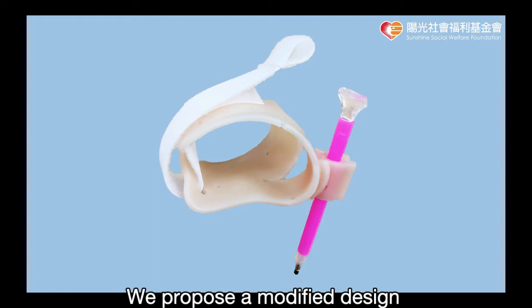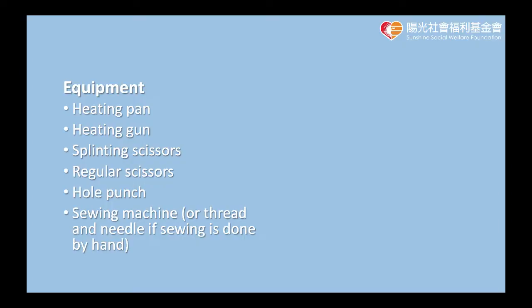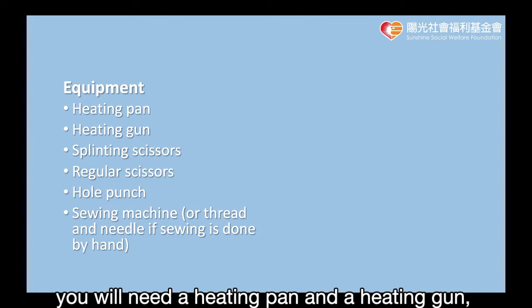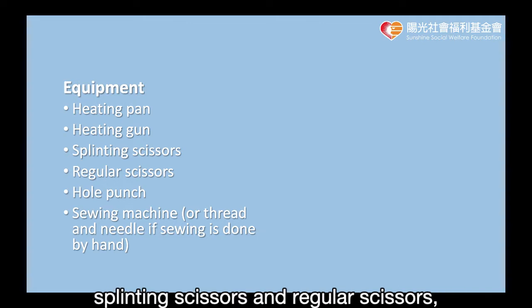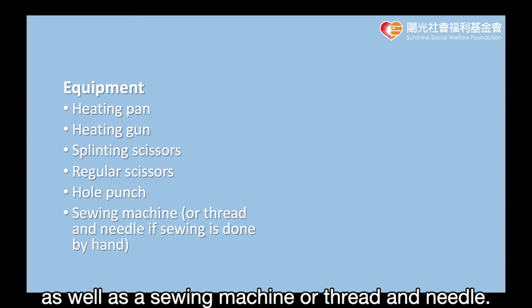We propose a modified design that solves this problem. To make the grip aid, you will need a heating pen and heating gun, splinting scissors and regular scissors, a hole punch, as well as a sewing machine or thread and needle.